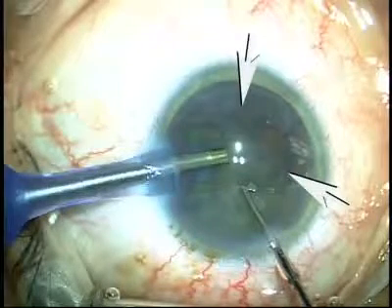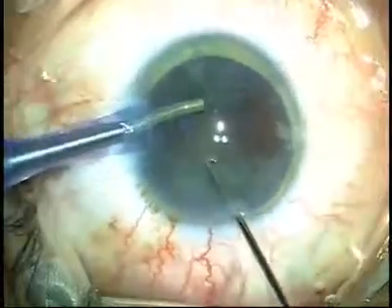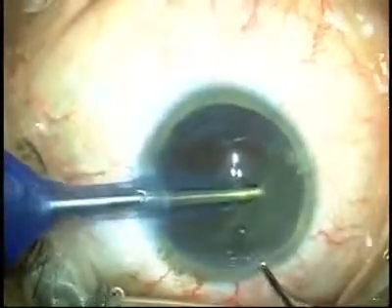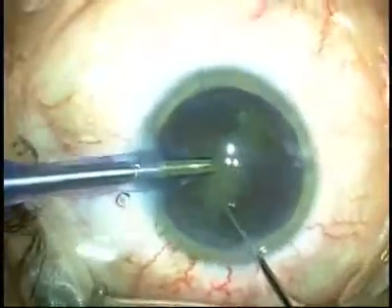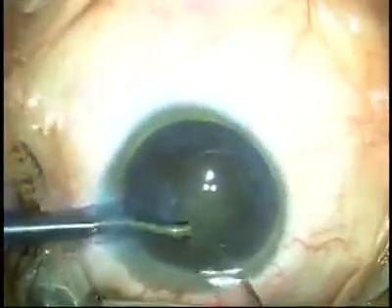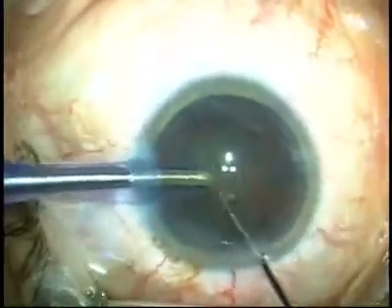This indicates that the Helon 5 is being rapidly evacuated from the chamber. The second bounce is seen with the second piece, and essentially all of the Helon 5 is now out of the chamber. So this fastball technique works extremely well.